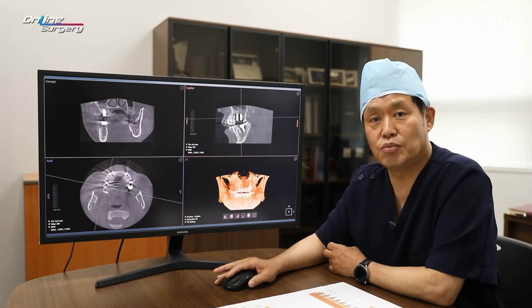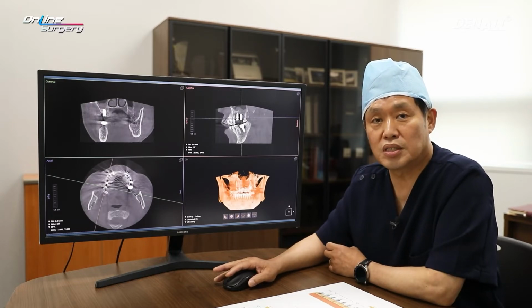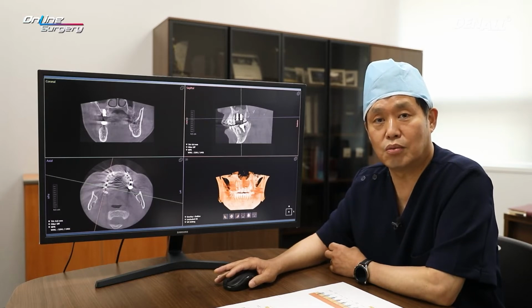In this surgical video, I hope you understand and focus on the drill sequence and stopper. I believe it will be of great help to you. Please enjoy the video clip.